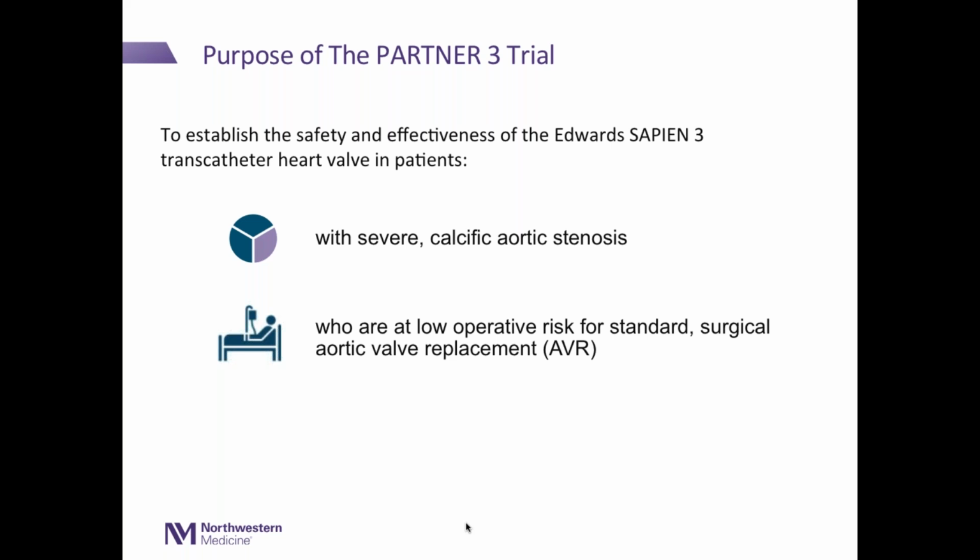The purpose of the Partner 3 trial, which is a trial that we're enrolling here at the Bloom Cardiovascular Institute at Northwestern Medicine, is to find patients with severe calcific aortic stenosis. Secondly, these patients should be low operative risk for standard surgical aortic valve replacement. Next slide.